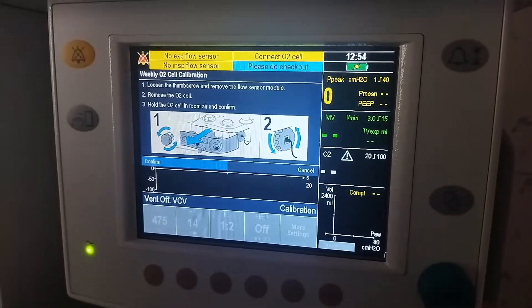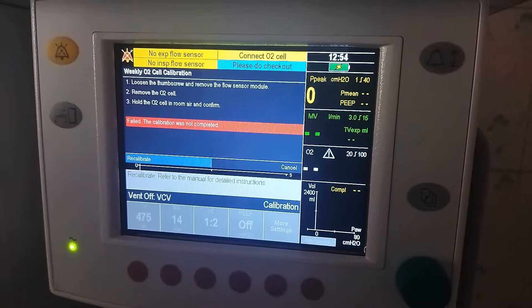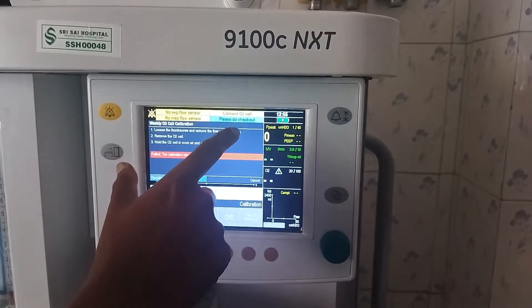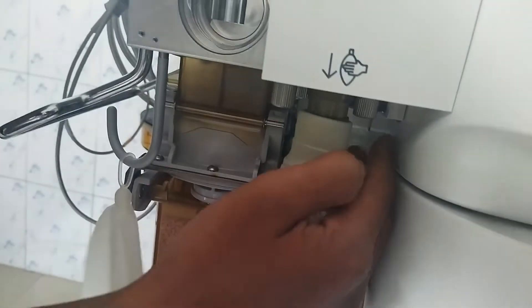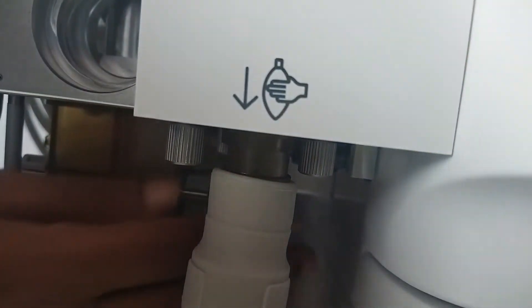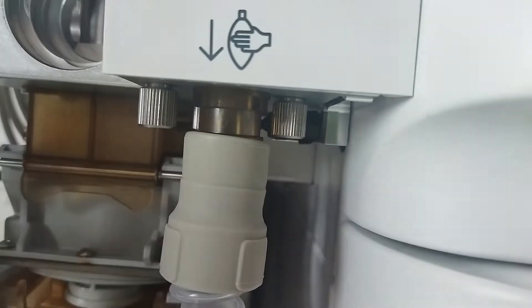Press control. You can see it is showing 'Connect O2 cell.' You have to come back and check the connection here — the O2 wire is connected to the machine through a plug. You have to properly connect it and then try again.